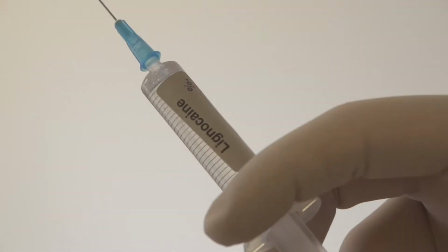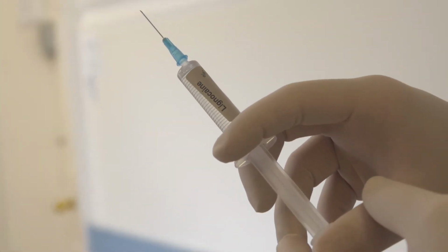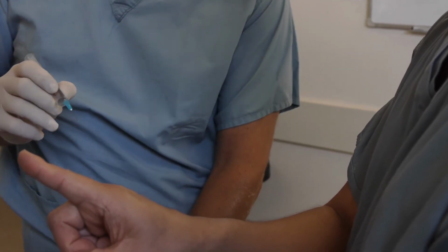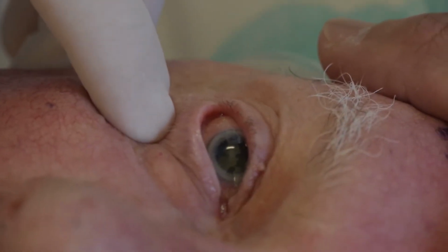So I've 5 mils of 2% lignocaine. It's a 23 gauge needle, 25 millimeters in length. And I orientate it so the bevel faces towards the cone of the muscle, so the injection will be carried in towards the cone and the nerves.